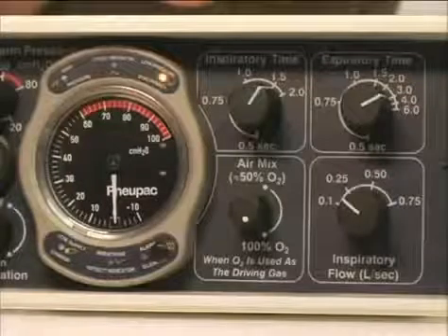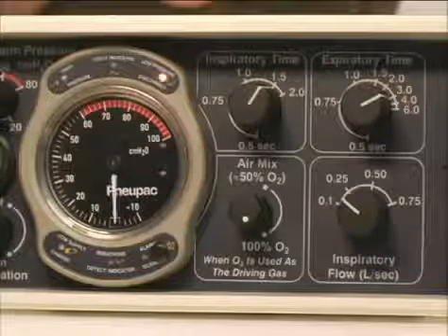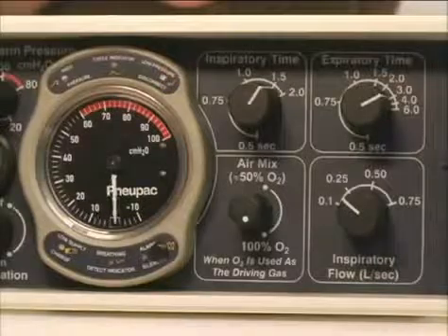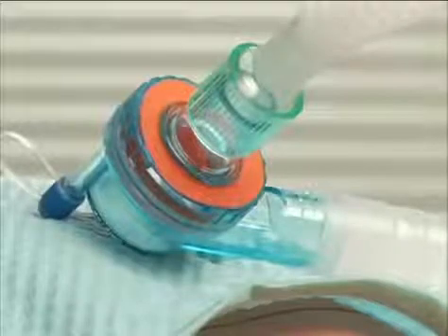If inflation pressure is too low, especially if it dips below 10 centimeters of water pressure and the low pressure alarm sounds, first, check for leaks. Second, check your ventilation parameters. Third, check the patient valve for proper functioning.